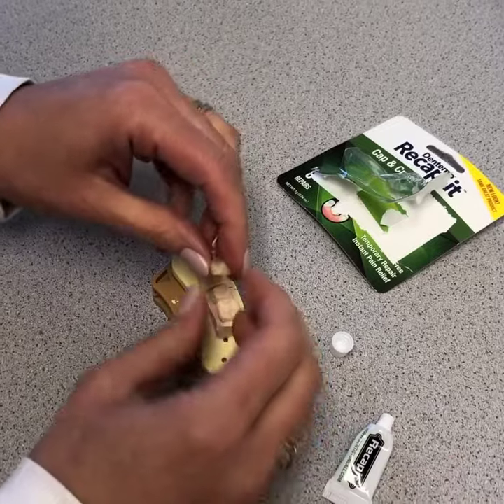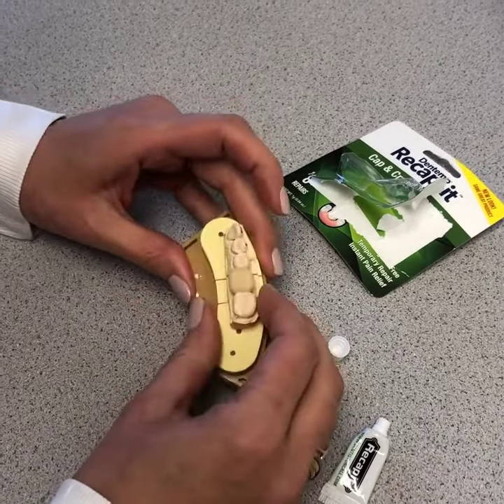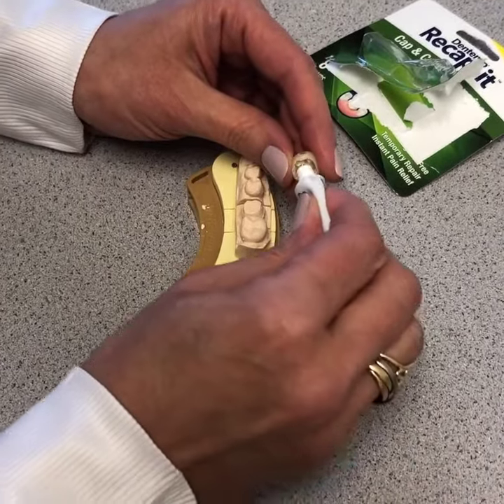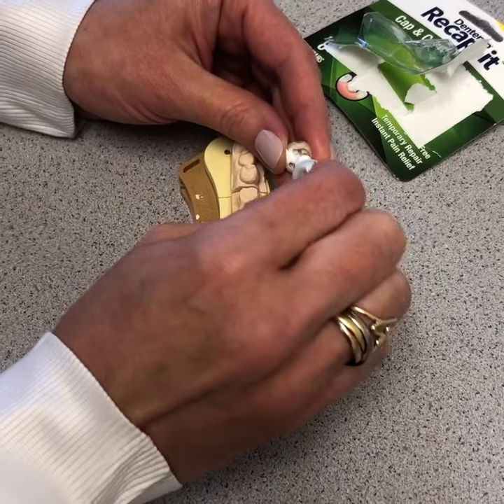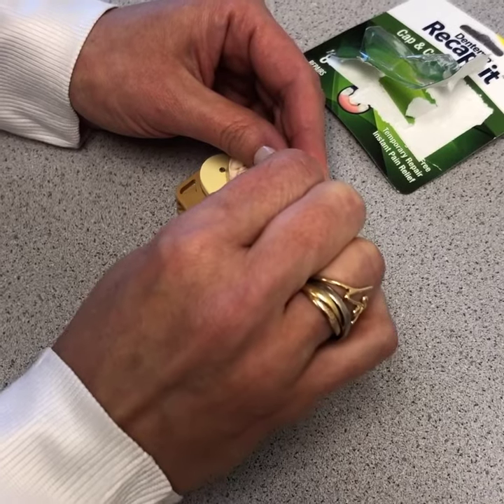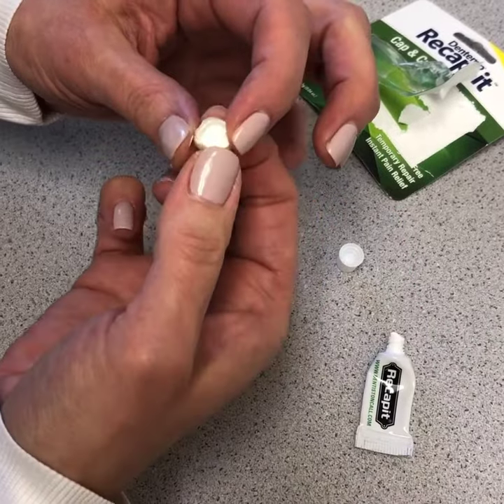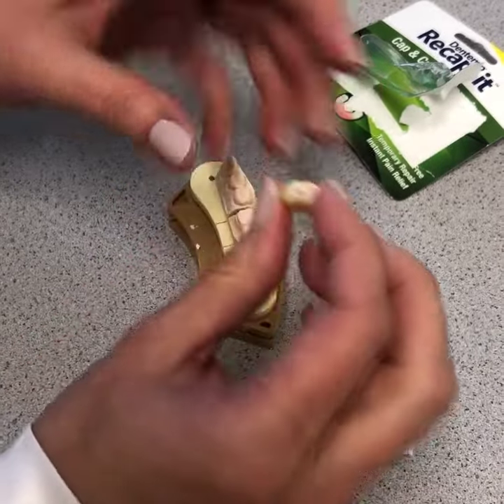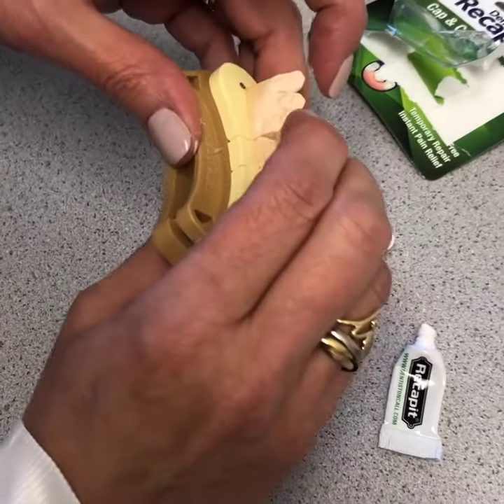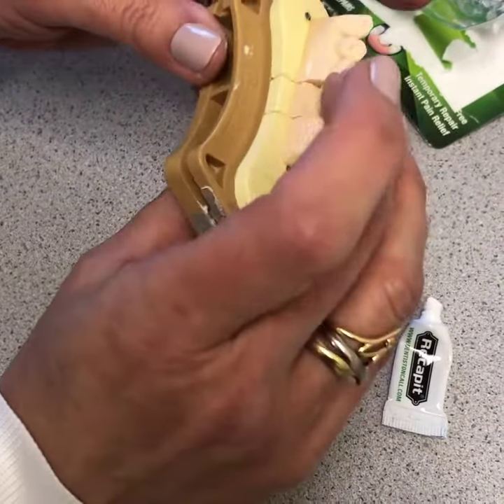Now this is your loose crown that came off. Make sure that you try it in first and know which way it goes in before you put the cement on. Then you turn it around and squeeze a little bit of that paste in there — you can use the tip of a Q-tip or just the tube tip itself. Remember, I made a mark on the back of it knowing which way it goes in.